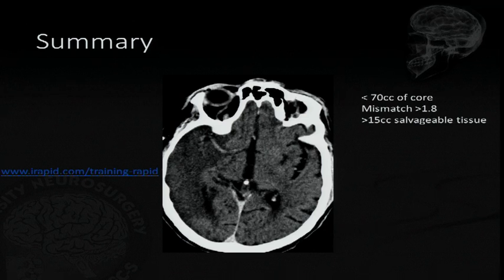Even if your stroke case has an LVO and you want to practice, just order a CT perfusion and see how it looks. We will officially be rolling out in October. So this September is for you to order as many as you want and just see how they come out and look at the maps and all that. The protocols will change October 1st, and that's when we're going to try to do them just for the ones that really need them.